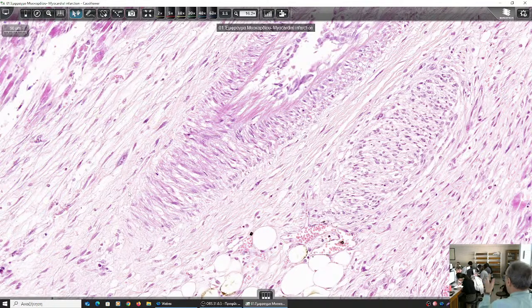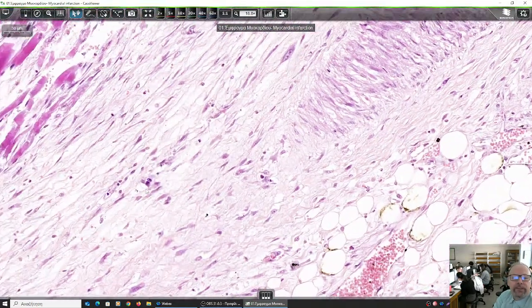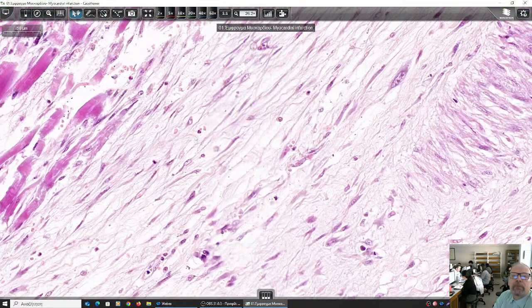That means that we had the necrosis, the accumulation of neutrophils. We have the formation of granulation tissue, and gradually we have scar formation. So what we see here is an accumulation of fibroblasts, and if we see any inflammatory cells here, they would be like this. What is this inflammatory cells? Have a look. This one, for example. They're mononuclear cells.